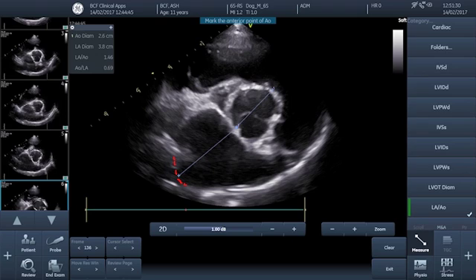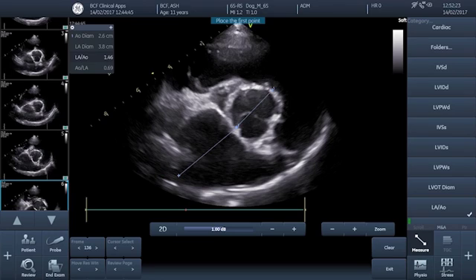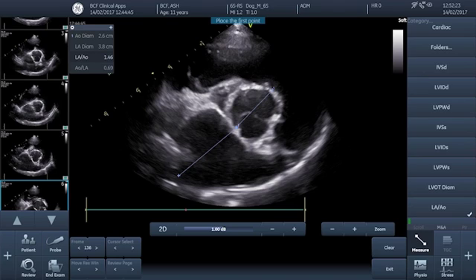Once you've completed those two measurements the machine calculates the LAAO ratio for you. If your machine doesn't, it's simple maths: divide the diameter of the left atrium in centimetres by the diameter of the aortic root in centimetres. That should give you a ratio somewhere between about 1 and 1.5 — just as an approximate check that you're in the right order of magnitude. If you're getting figures of around 0.6 or 0.7, bear in mind that's about the inverse of 1.5, and you may have inadvertently measured the two dimensions in the opposite order, effectively giving you aortic root diameter divided by left atrial diameter rather than the other way around.